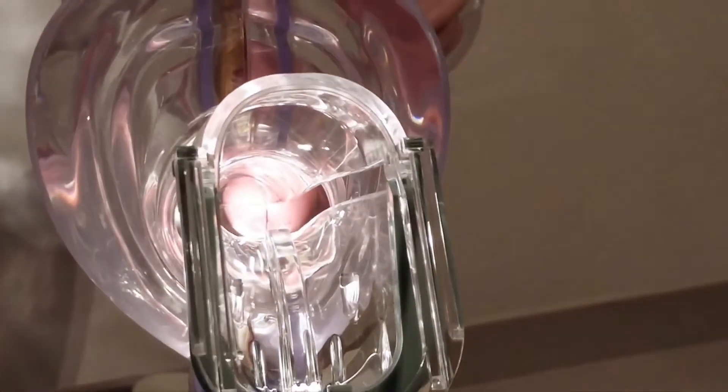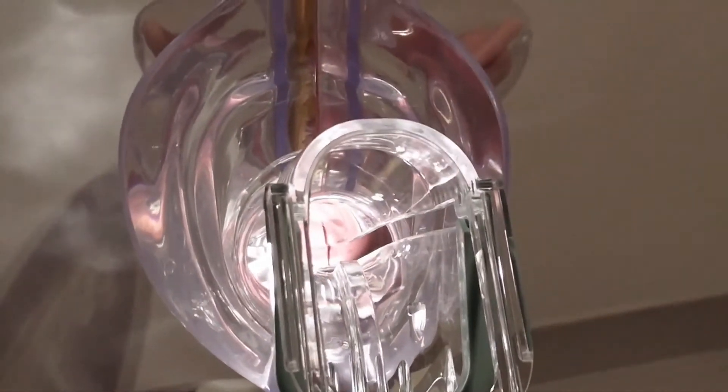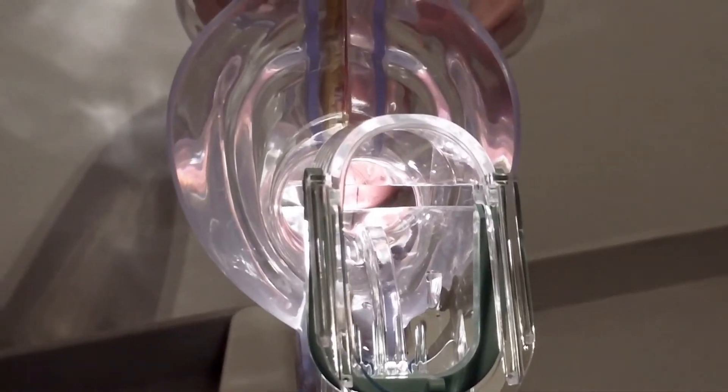Usually there is a bit of smoke coming out and we use suction device to remove the smoke. And sometimes there is a bit of bleeding which will stop with another little device.